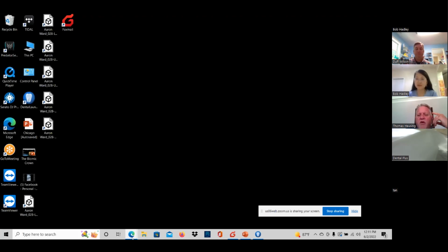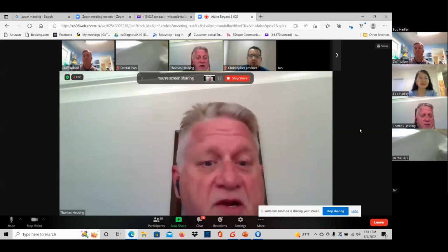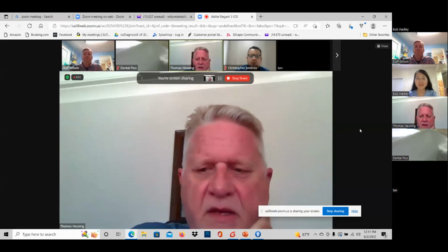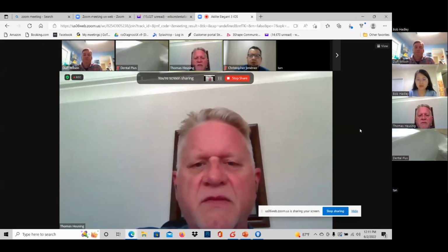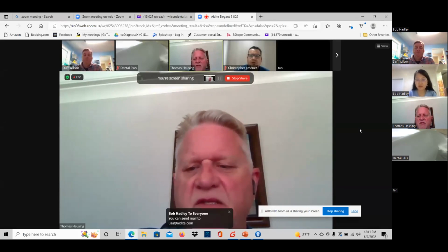Someone asked, what's the warranty? I believe it's a 12-month warranty, a 1-year warranty. Am I correct with saying that, right, Fiona? Yes. Okay. Do we have any other additional questions? If not, I'd like to give you our promo for June for the iOSs, if possible, unless you have any other questions.